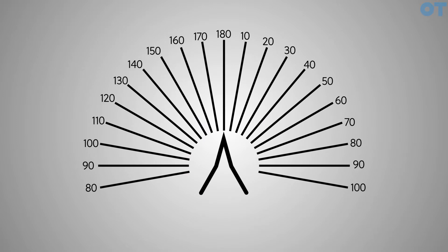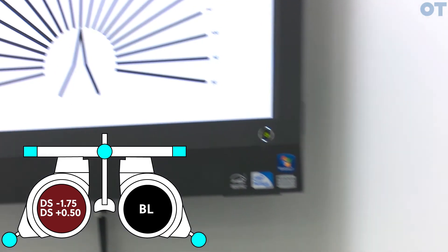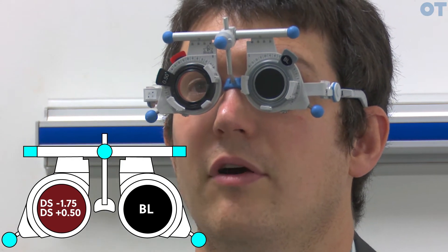We're going to ask the patient to look at the fan chart and tell us where the lines appear sharpest. So looking at the chart, thinking of it as a clock face, where do the lines look sharpest for you? Between 1 and 2 o'clock.